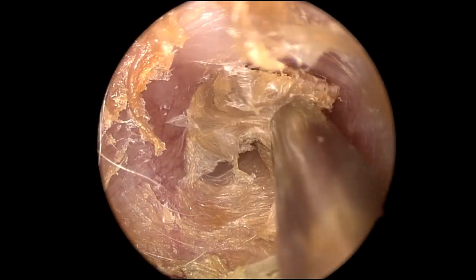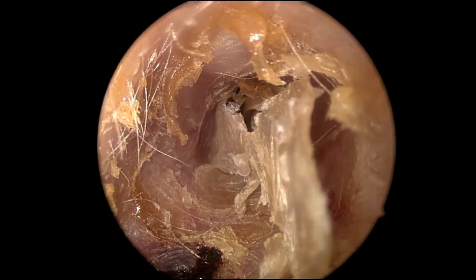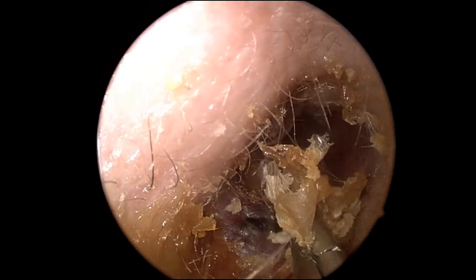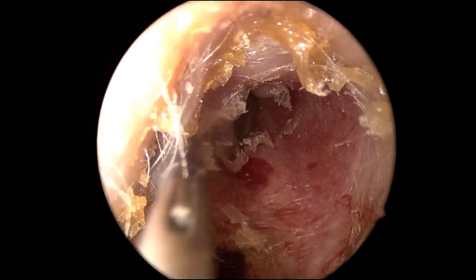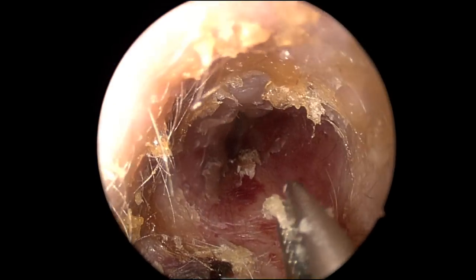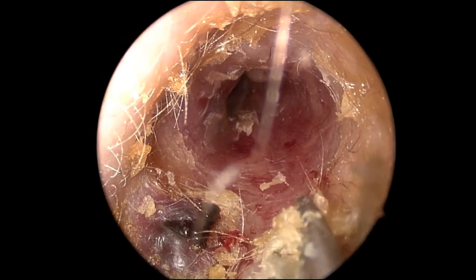This needs to be done very delicately and carefully to avoid ear canal bleeding. A few more pieces are left to remove, and then we'll be able to visualize the eardrum — again, osteoma superiorly. Routine use of Q-tips is to be avoided, as this will actually push the wax further into the ear canal.